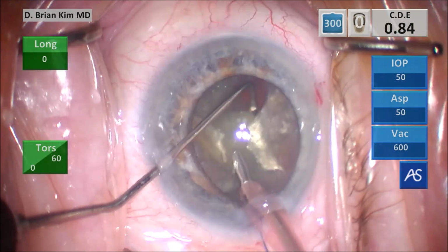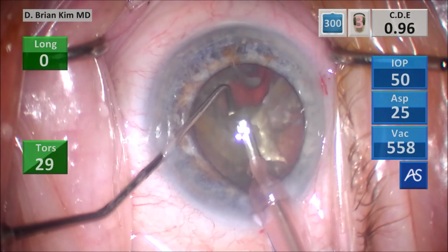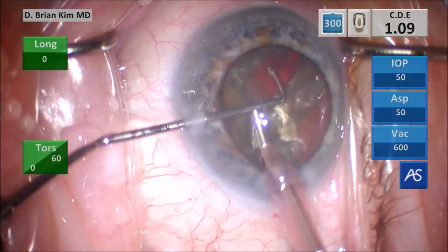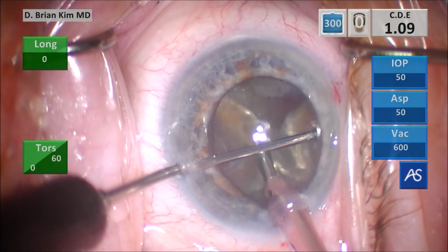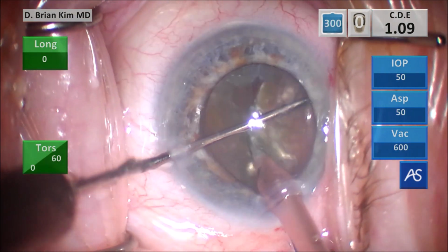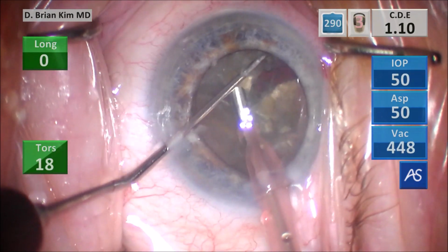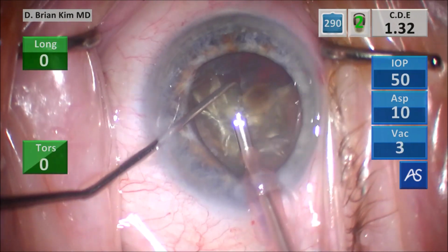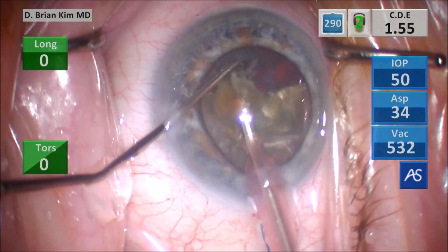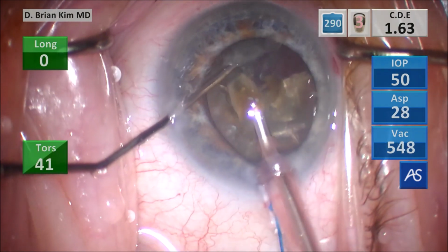Crushing that one fragment between the two instruments and then emulsifying it. So I'm getting around that second quadrant with the chopper, pulling it centrally towards the phaco tip with another cross chop maneuver. I'm able to bisect that second quadrant in half and then grabbing that fragment, crushing it into smaller pieces, and then emulsifying the lens pieces.